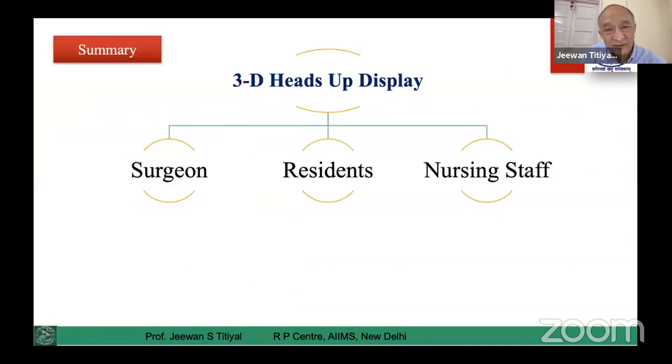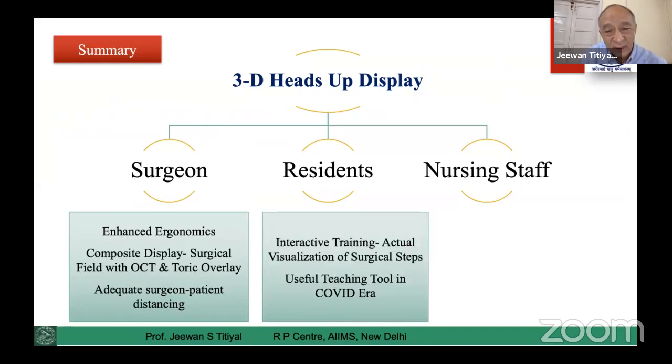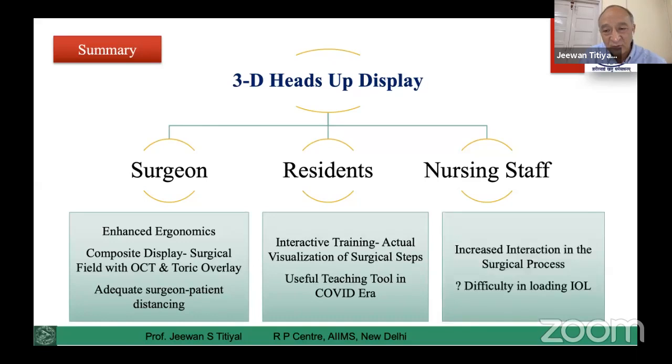And in terms of 3D heads-up display, it's beneficial to the surgeon, definitely enhances ergonomics, better display, and better overlay system, especially for OCT and toric overlays, much better. For residents, training-wise, it is far better. I understand in future, most surgery will be with a 3D heads-up display. And I know that many more companies are going to come. The cost will go down, and it will have a more effective utilization of surgical time also.